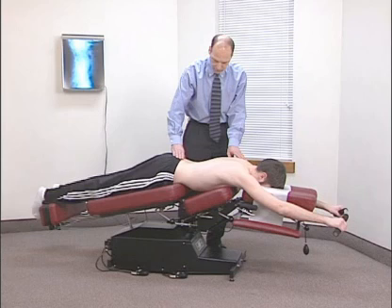After the table has completed 5 or more cycles, the patient has adapted to motorized flexion distraction. It is normal for a patient to feel a pull or a tug in the low back muscles as the table descends. If the patient is feeling moderate or severe discomfort, stop the table and discontinue flexion distraction. This procedure should be tested on every new patient or new injury.